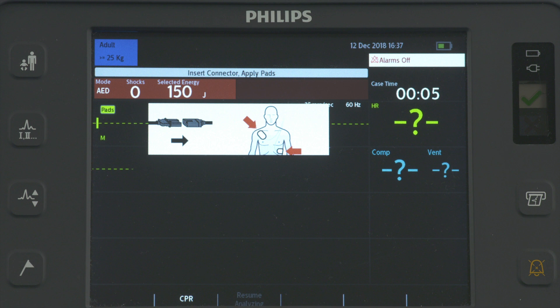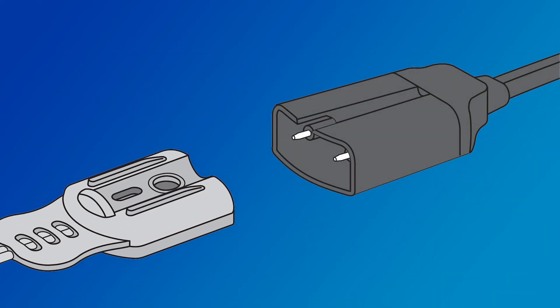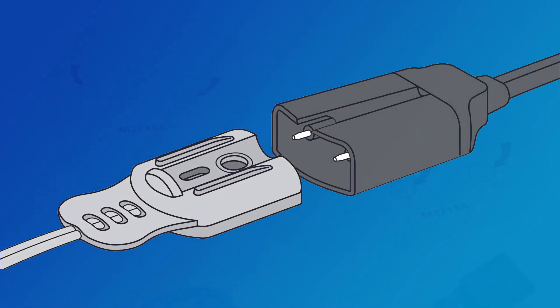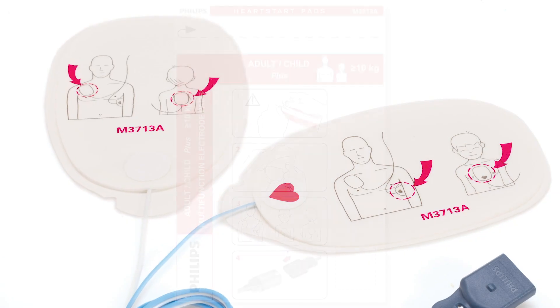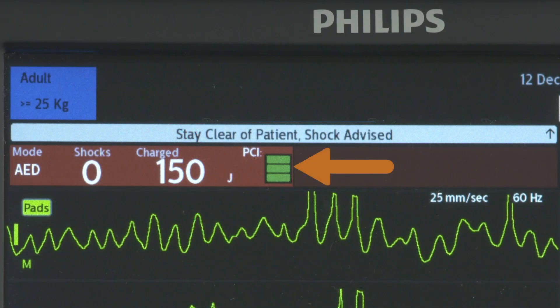If not, it advises you to connect the pads to the pads patient cable. Apply the multifunction electrode pads as directed on the package. The Patient Contact Indicator is located at the top of the display screen. If the Patient Contact Indicator is orange or red, adjust the multifunction pad to maximize contact.